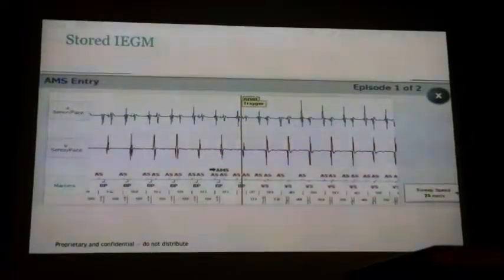So if I was working the PSA and the physician puts the atrial lead in, I'm not just looking at the size of the P wave. I'm looking at its morphological characteristics, and also if there's an R wave coming through, a big R wave. But when you test during implantation, you test for sensed R wave. Sometimes you test for paced R wave, in the configuration of the pacing spike. Yeah, that's true.